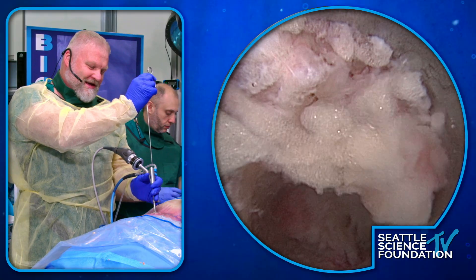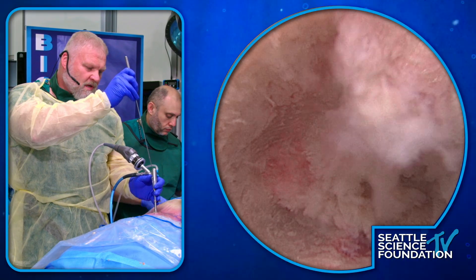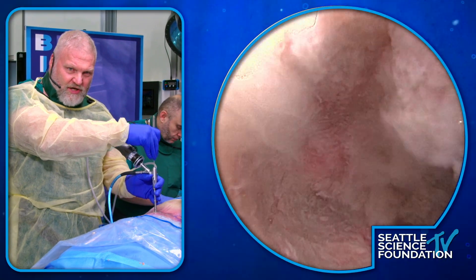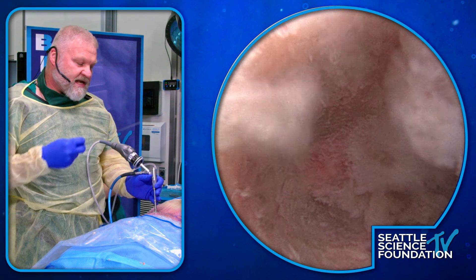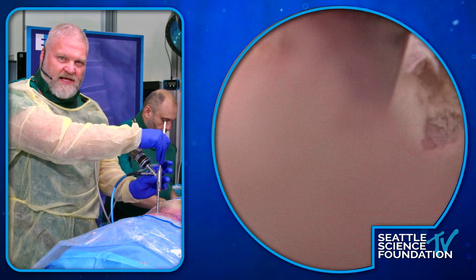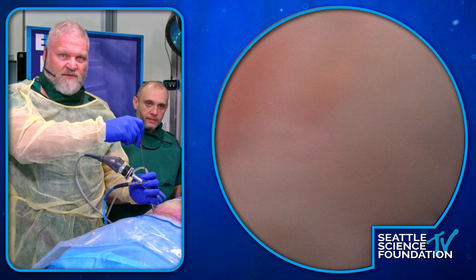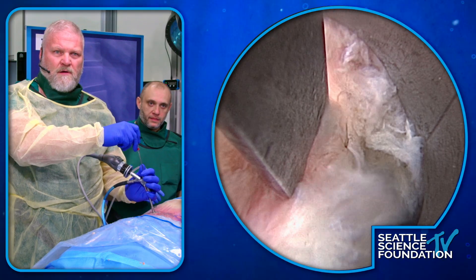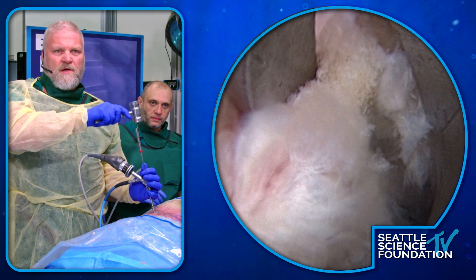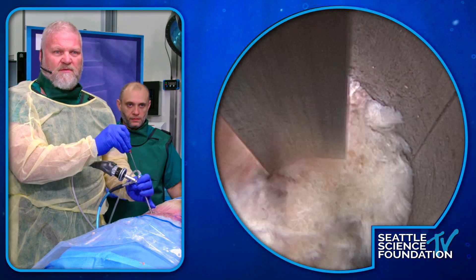I'm just going to show you how to remove some bone, because where you do it is less important than how you do it. You've got some soft tissue attachment here — looks like some sort of ligament — and there's some bone. This is a good spot for the gouge. Come right down here with the gouge, lay it right against the bone — you have a mallet. I like you have unbelievable control with this; you can feel when you go through. Here's a little bit of bone right there.